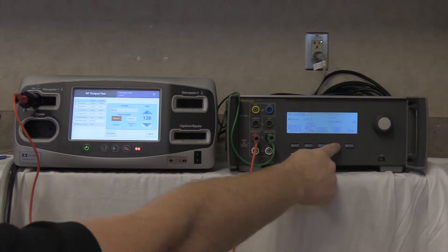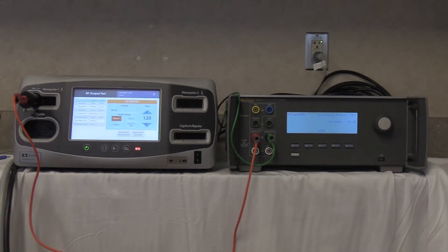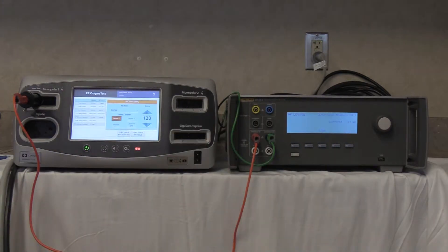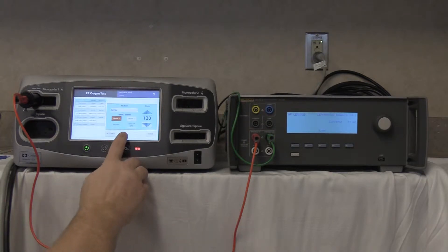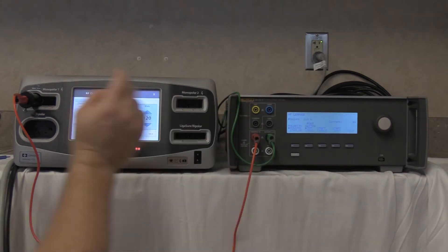Start continuous on the QAES-3 and activate on the FT10. Our reading is 49 milliamps. The maximum allowable reading is 150 milliamps per the service manual. Deactivate on the FT10 and stop on the QAES-3.